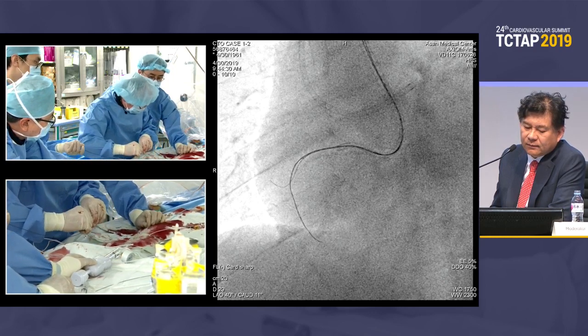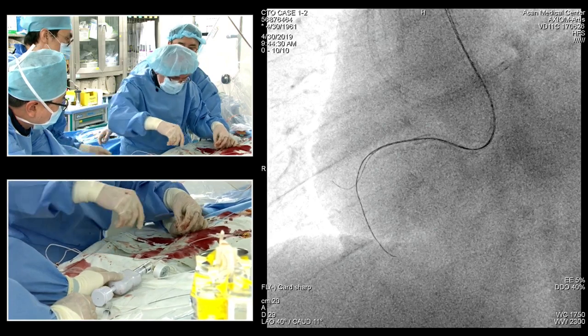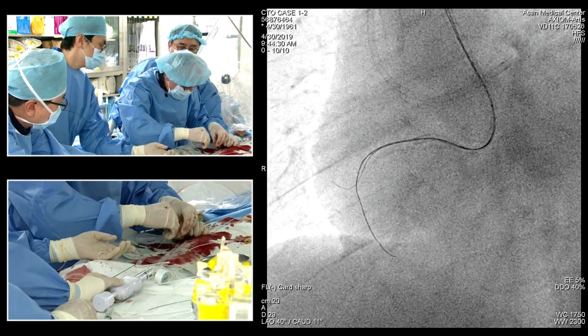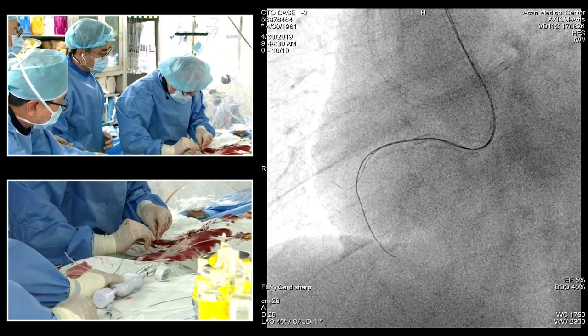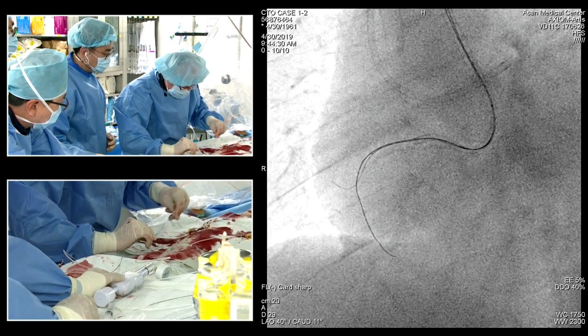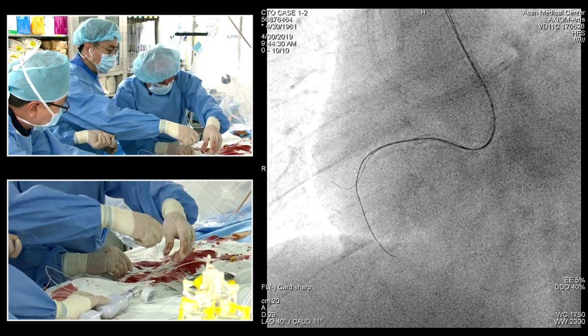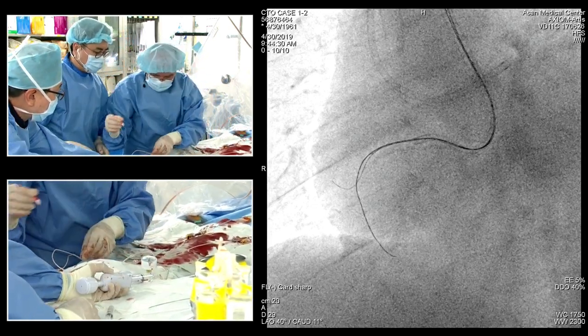Okay. Well, the XT is just my home wire. So I'm most familiar with the XT. And I don't see much difference from the XTA. So this is our Gaia. Yeah, Gaia second, and this is the XT. Yeah. Mark the XT maybe with the wire.